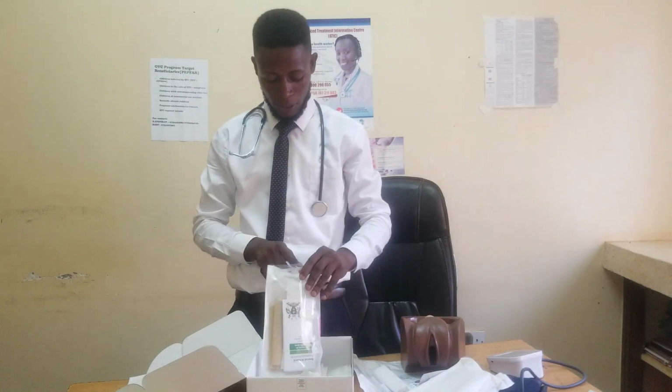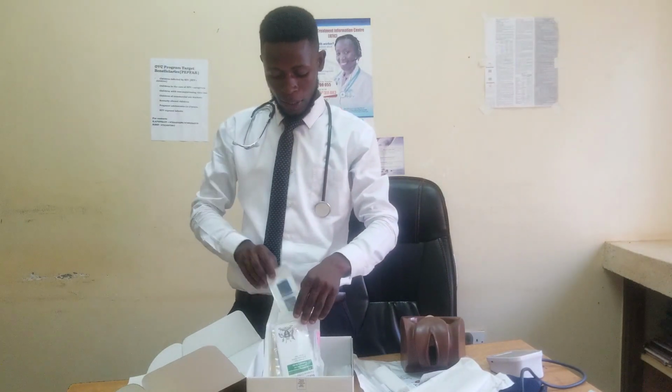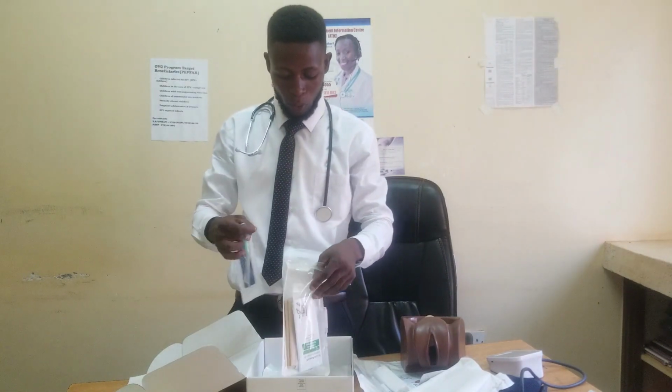It comes with a pair of scissors. As we shall see, it comes with two combs and a pair of scissors, so we shall look at different debris and pubic hair. On matted hair, you cut, then you place the hair you have cut on this white paper. Please, you should have gloves put on.